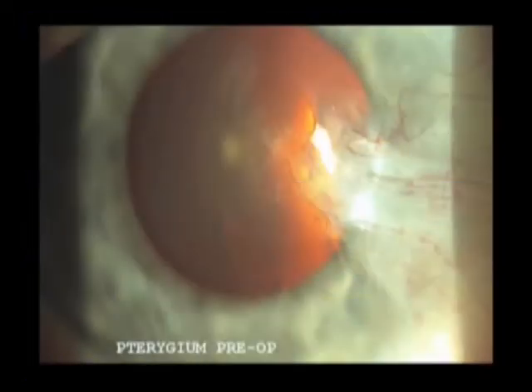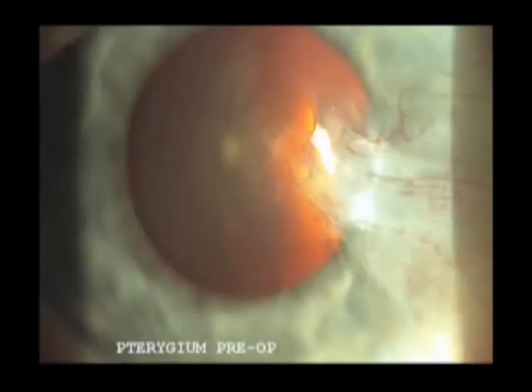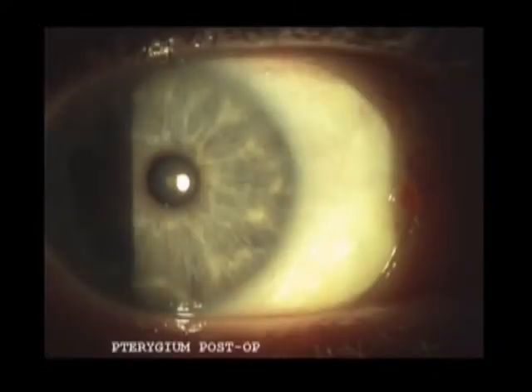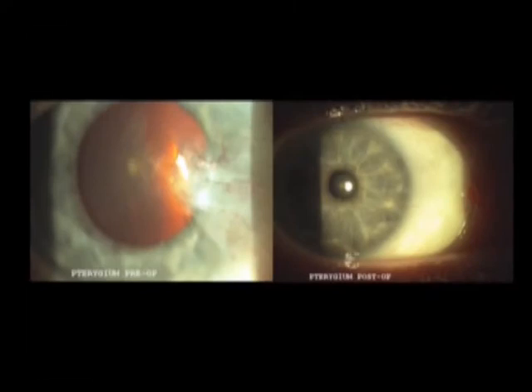For example, in ocular surface pathologies like advanced pterygium, a sutureless amniotic graft can be used for excellent clinical and visual outcomes.